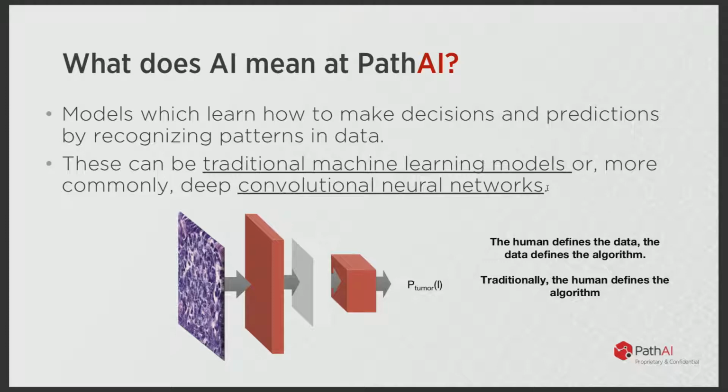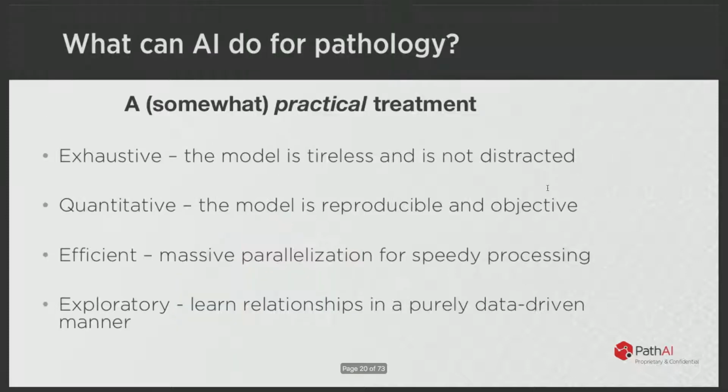A lot of what we think about at PathAI, and what I think is really important in this area of ML for medicine, is generating the right data set, then using things like deep learning to optimize all of the features in a data-driven way, and then thinking about how to use the outputs of these models intelligently and validate them in a robust way, because there are many ways to be fooled by artifacts and other things.